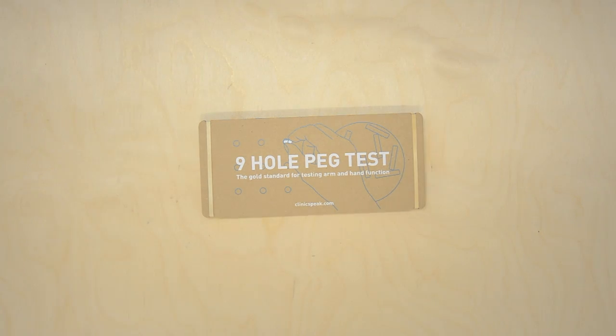The 9-hole peg test is the most widely accepted way of monitoring arm and hand function in clinical trials. This cardboard version allows you to self-monitor at home.